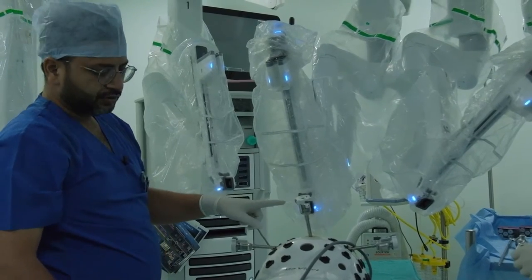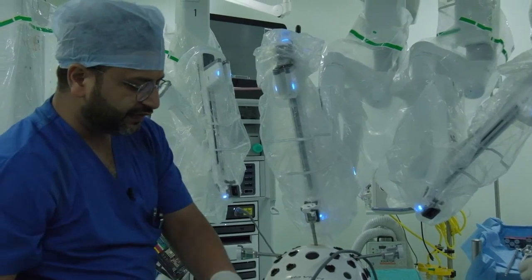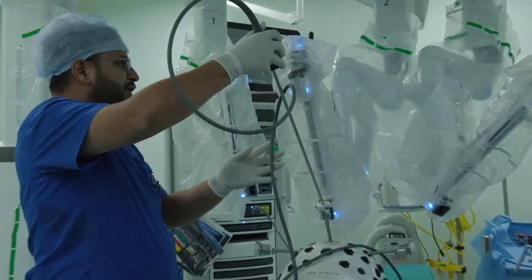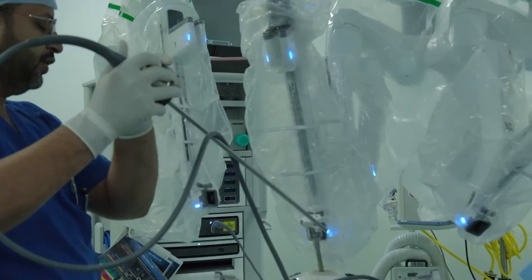Install the endoscope for targeting. Now the system is asking us to install the endoscope. We secure the cable and we put the endoscope inside. We switch on the illuminator.